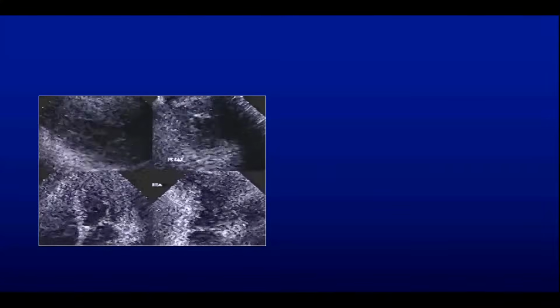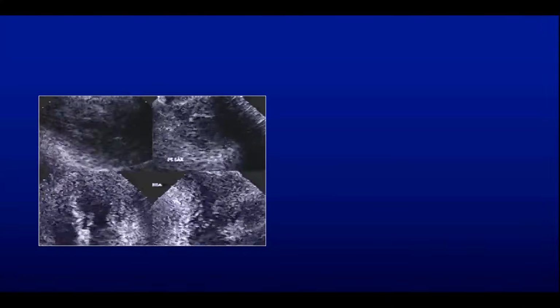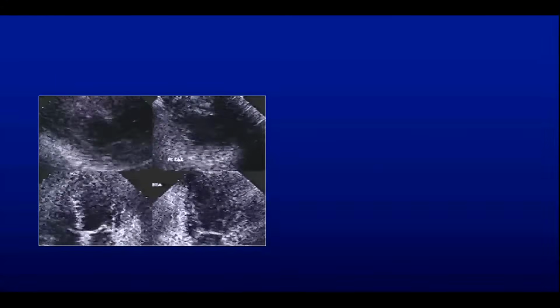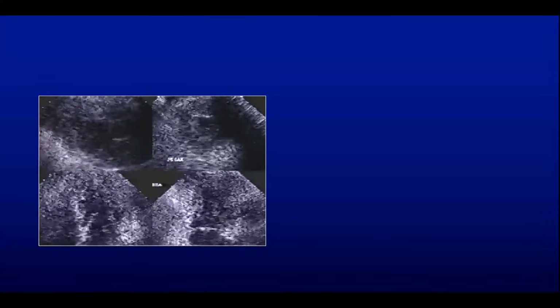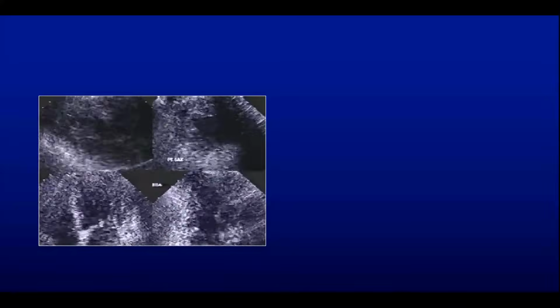And this, I haven't seen another case of it. I was involved directly in it. A patient of our Dr. Kleiman came in, and I said, this looks normal to me. I didn't see anything, and I gave you the best pictures. All the others are decent. He said, well, the EKG is very abnormal. And this was in the early days of contrast. I said, well, why don't we bring the patient back and see what the situation is?